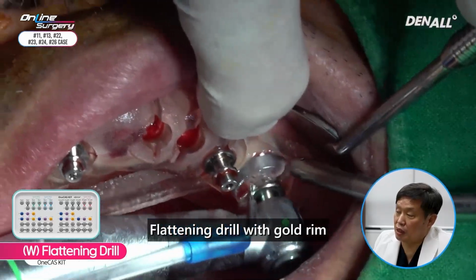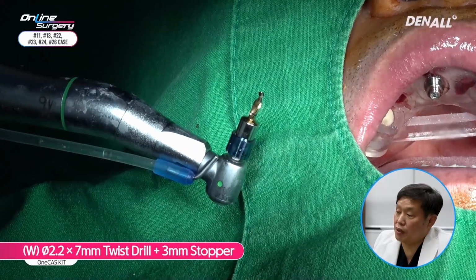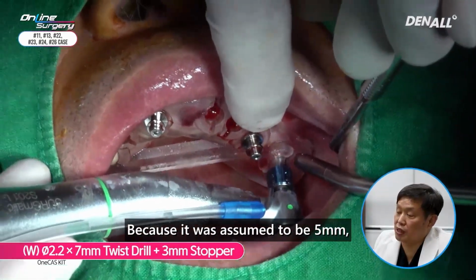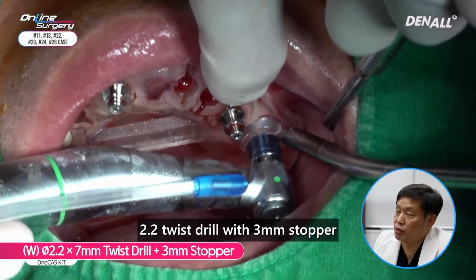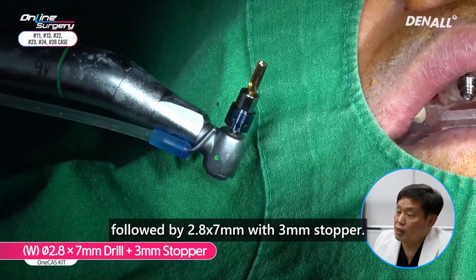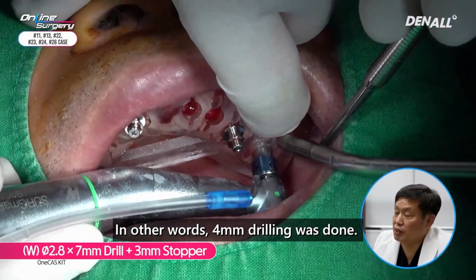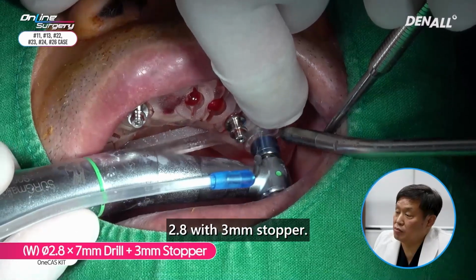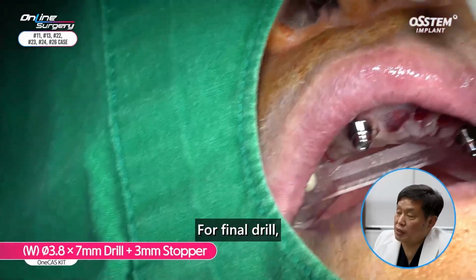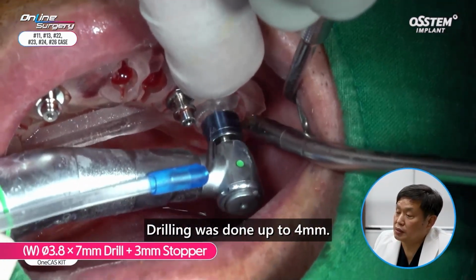Flattening drill with gold rim was used to do flattening. A 3 millimeter stopper was used because it was assumed to be 5 millimeter. 2.2 twisted drill with a 3 millimeter stopper was used to drill 4 millimeters, followed by 2.8 by 7 millimeter with 3 millimeter stopper. In other words, a 4 millimeter drilling was done. 2.8 with 3 millimeter stopper. For final drill, 3.8 by 7 millimeter drill with 3 millimeter stopper. Drilling was done up to 4 millimeters.